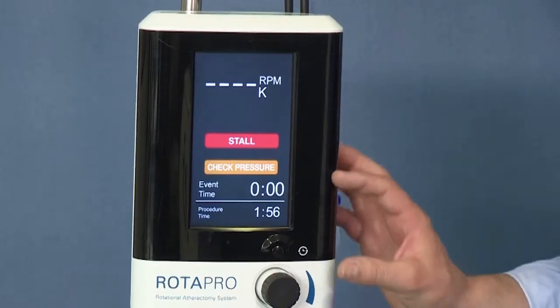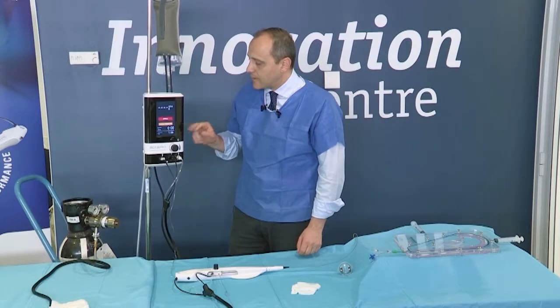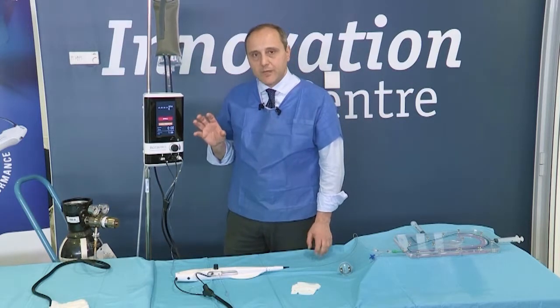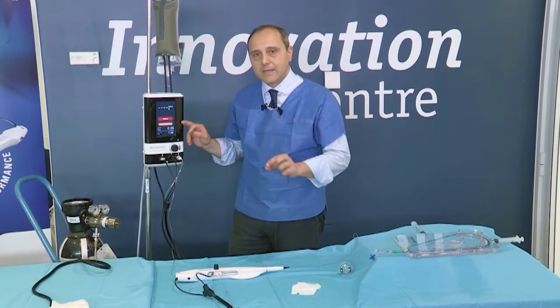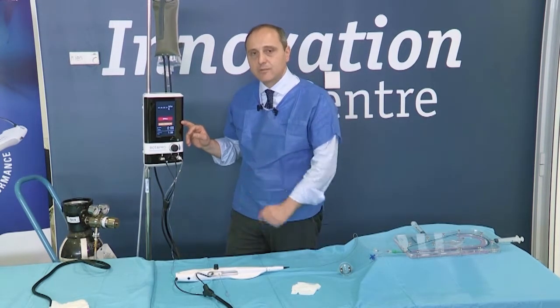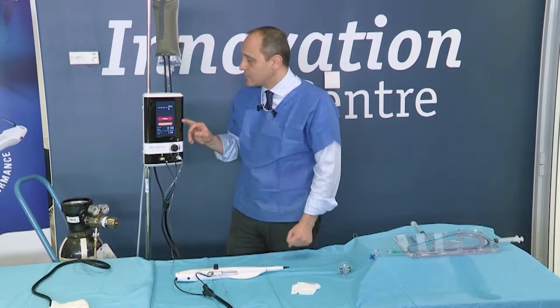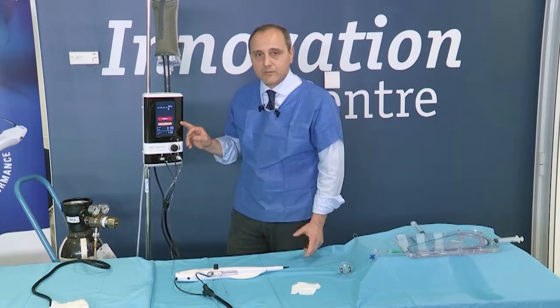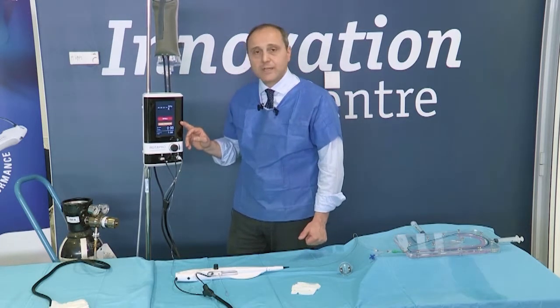If you see these two signals on the console, basically stall and check pressure, what does it mean practically? It means that either you have a leakage in the gas line that is connected to the rotablator system, or simply that the pressure provided to the system is just not sufficient. Remember, this should be 7 bar. How to fix this?